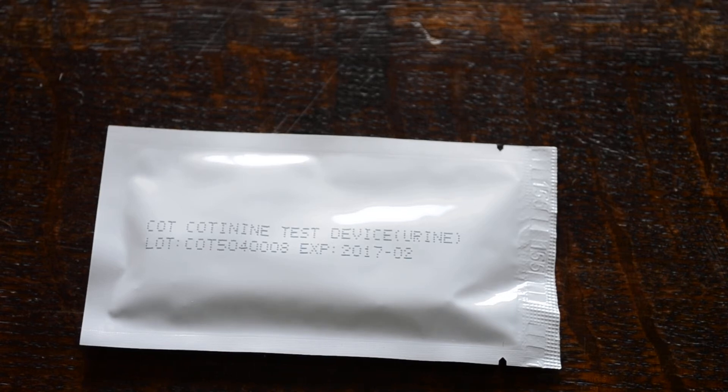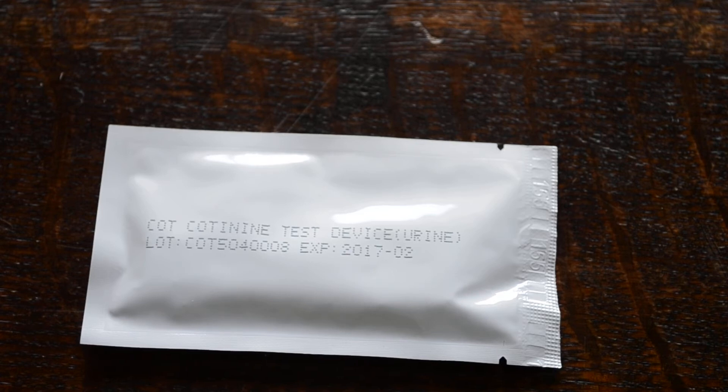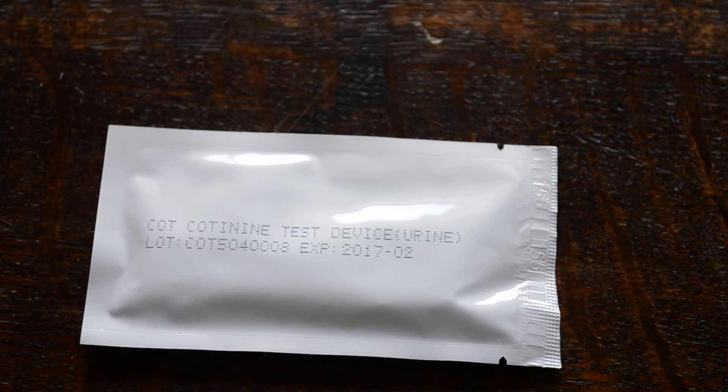Welcome to this video presentation. We're going to show you today the cotinine test device. Cotinine is the first metabolite of nicotine, so this is a smoking detection test. The cutoff is set at 200 nanograms, which means it will not indicate any passive inhalation of smoke. The cutoff is simply too high for that.